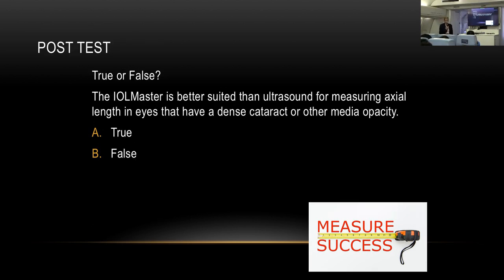True or false? Is this statement true or false? The IOLMaster is better suited than ultrasound for measuring axial length in eyes that have a dense cataract or other media opacity. False. The IOLMaster is not better suited for dense cataracts.